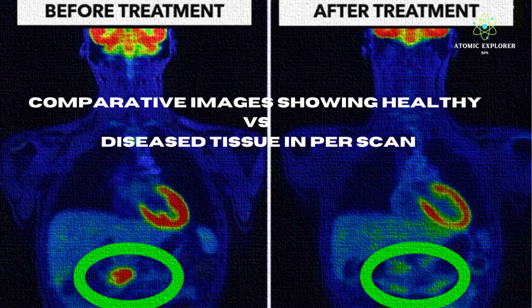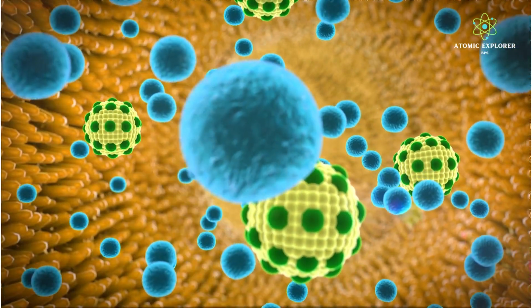After undergoing treatment, the PET scan on the right side shown in the figure reveals a remarkable difference. The once bright and metabolically active tumor has significantly reduced in intensity, as indicated by the much fainter signal within the surgical region. This suggests that the treatment has been effective in targeting and reducing the tumor's metabolic activity.